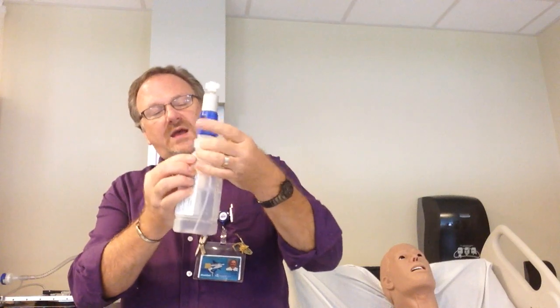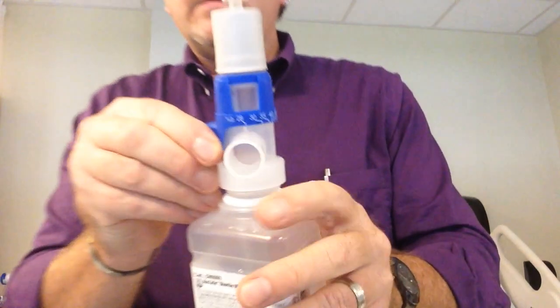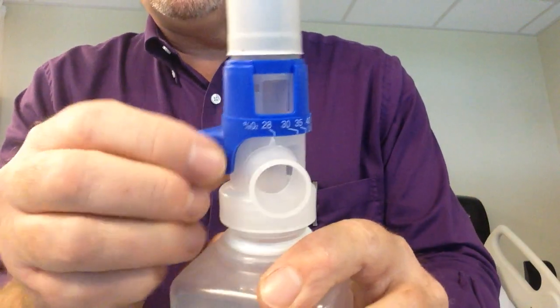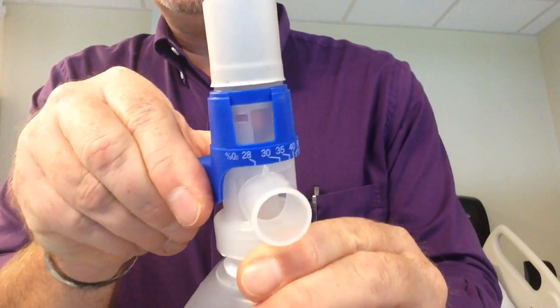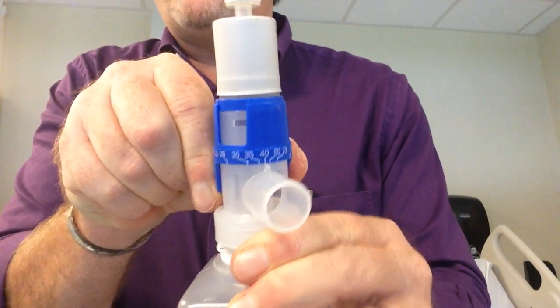Screw the water reservoir on. The arrow on the dial is what determines your FiO2. In this case I would be delivering 40%.